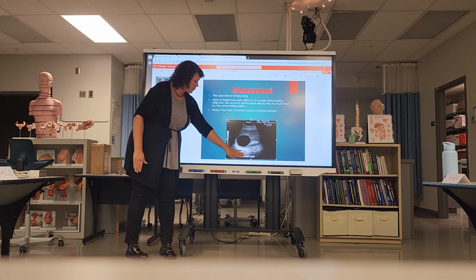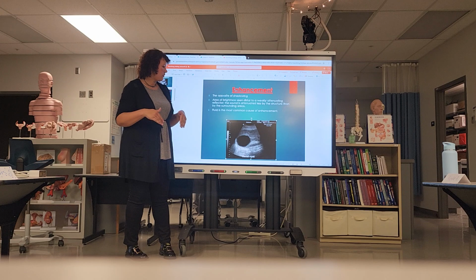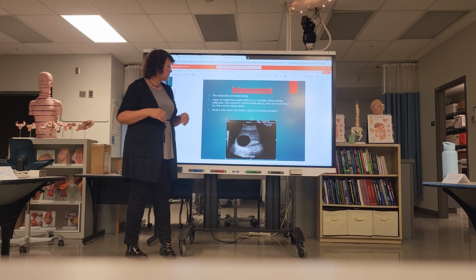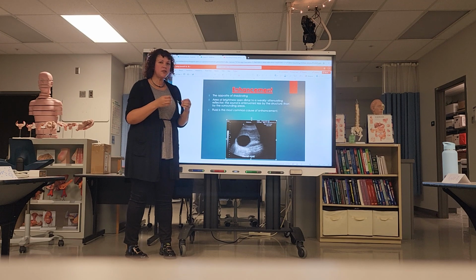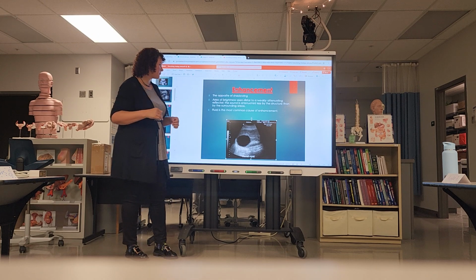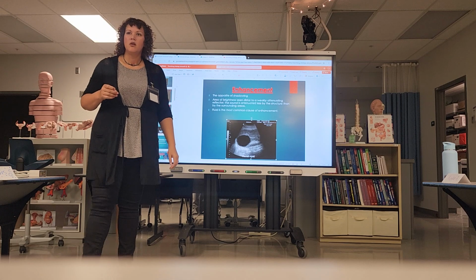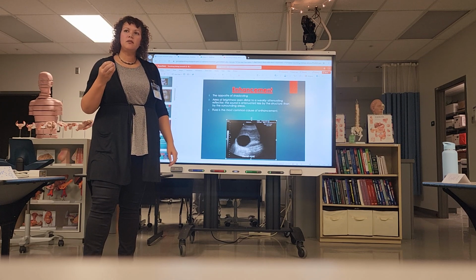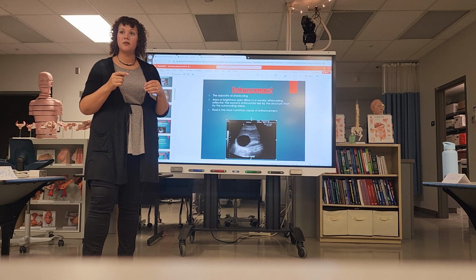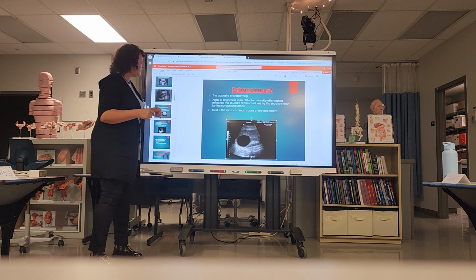So this will happen with fluid-filled structures. This enhancement will happen with the gallbladder, the bladder, cysts, abscesses, and sometimes even solid structures that have a fluid component. Does it happen with the ones filled with blood too? I think the blood is viscous enough that it doesn't create that enhancement. Sometimes it does though. Yeah? Can you repeat how it creates that enhancement again?